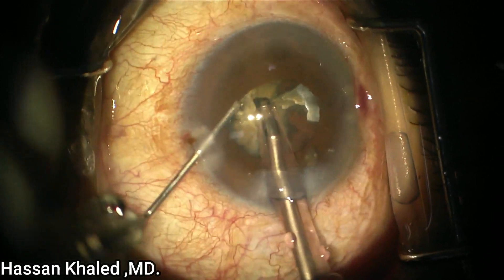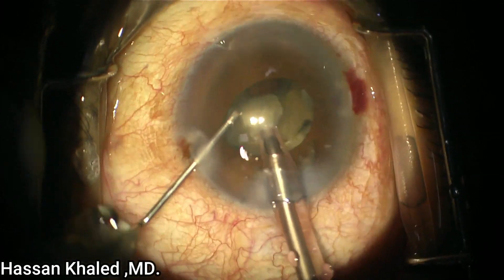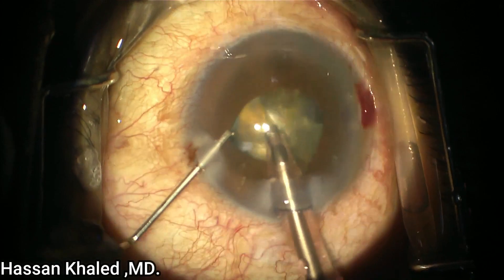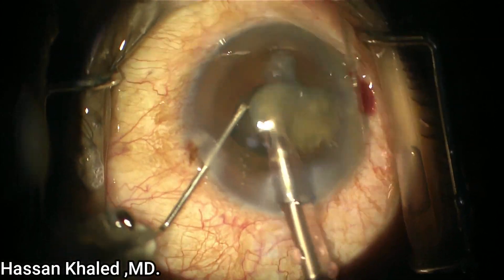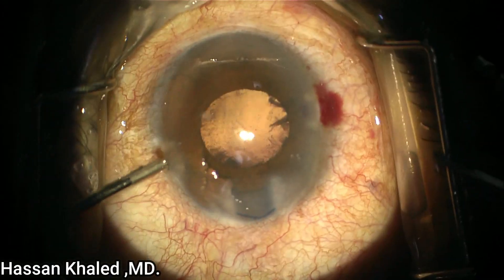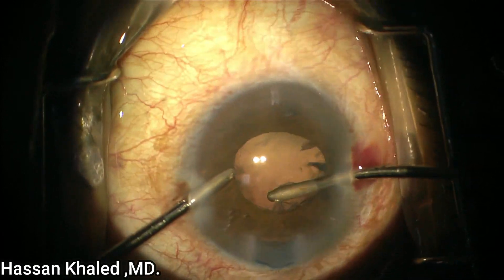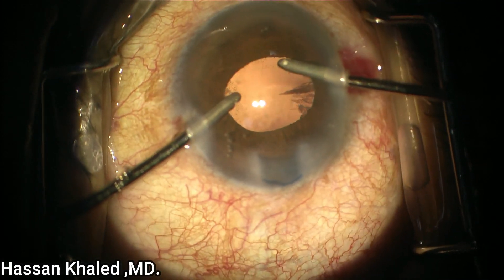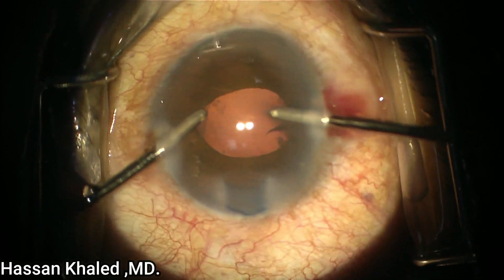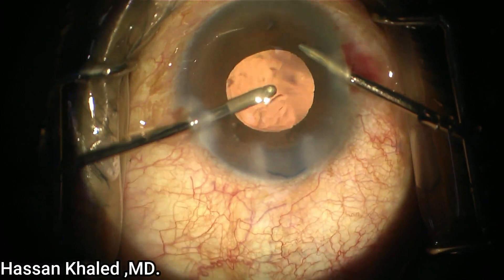Here you can see the last pieces. I push the iris slightly by the needle, then hold and do the emulsification of this dense cataract. Here you can see the end of emulsification. It's important to take the needle out before the phaco probe is removed from the anterior chamber. As you can see, there is not much cortex as the cortex was liquefied — I'm using manual irrigation-aspiration to remove the cortex.